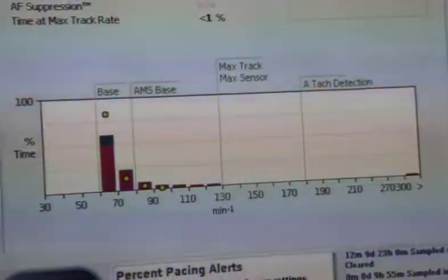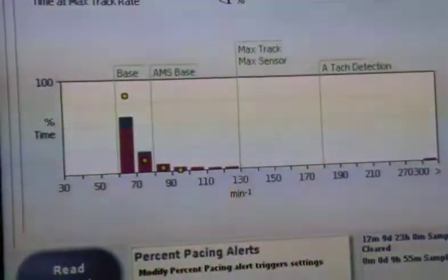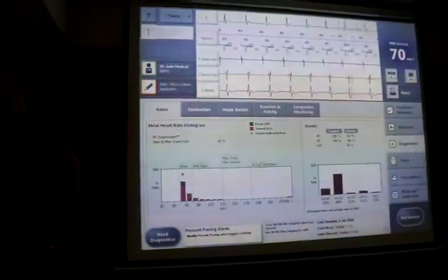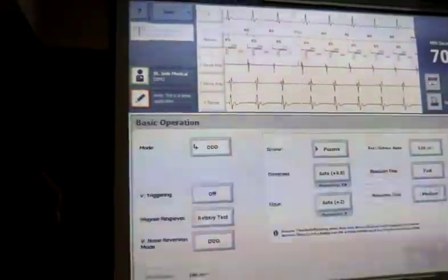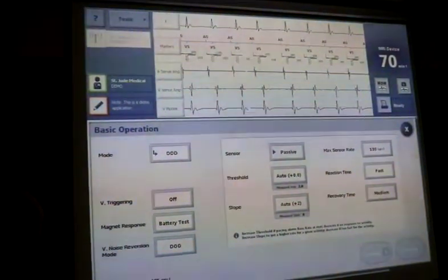but the heart rate curve is over to the right, there's a mismatch. Over here, faster heart rate. So let's say her atrial rate is going at 85, but her sensor is saying she should be at 70. You've probably got sympathetic nervous stimulation from heart failure, so probably they're not taking the beta blockers. So we're going to only use a sensor, absolutely only use a sensor, if the patient has got something wrong with her SA node, okay?